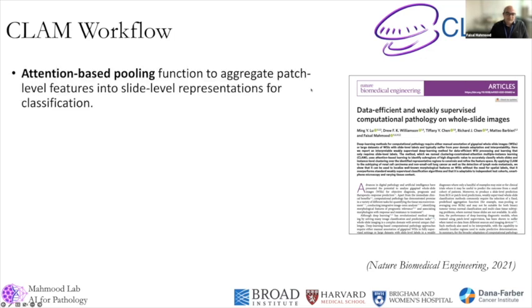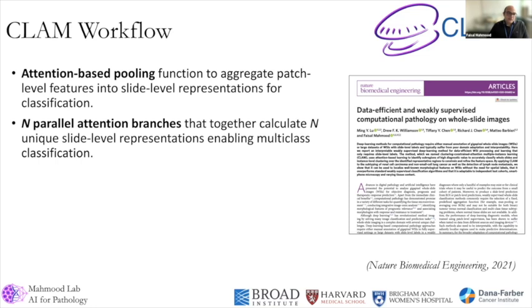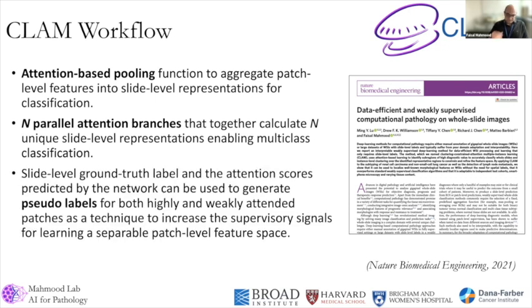And we used attention-based pooling, which means that for the aggregation function to generate a slide level computational representation, we learned what the most important patches are in the whole slide image. We also use n-parallel attention branches in some cases, which allows us to solve multi-class problems. Pathology in general is inherently multi-class. There can be many findings on a single slide.